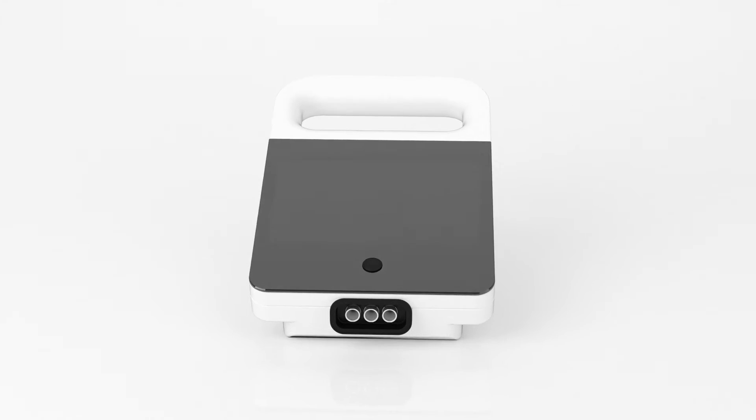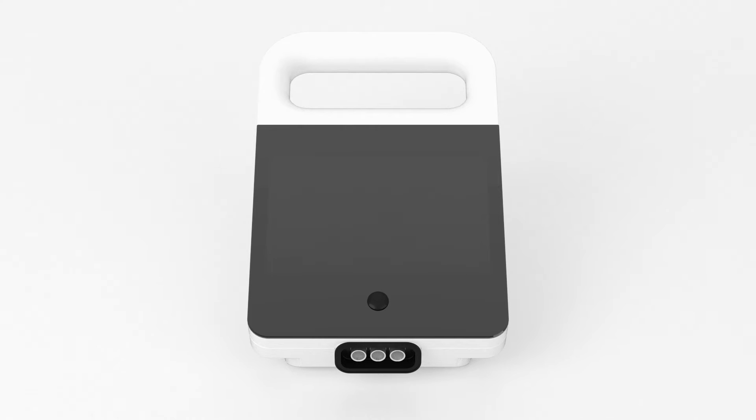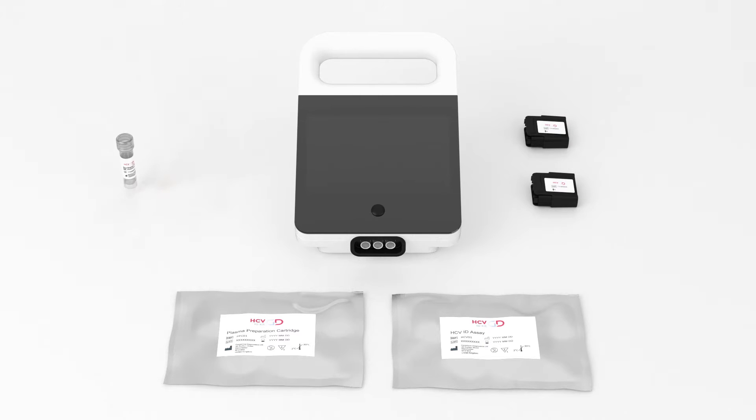Your GeneDrive HCV ID Kit components are a plasma preparation cartridge, an HCV ID assay tube, two cartridge lids, one tube of nuclease-free water, and one empty tube.